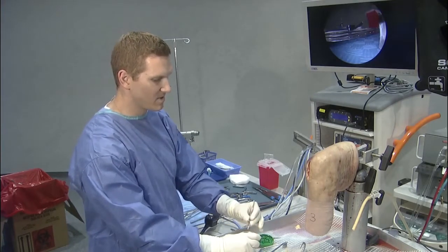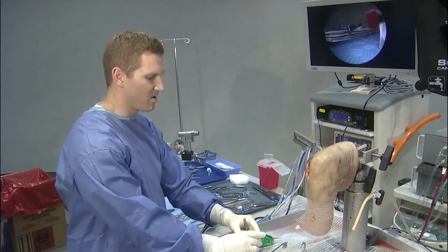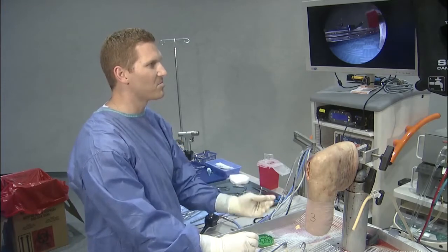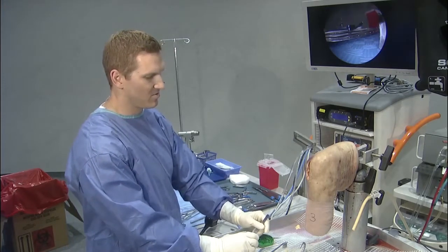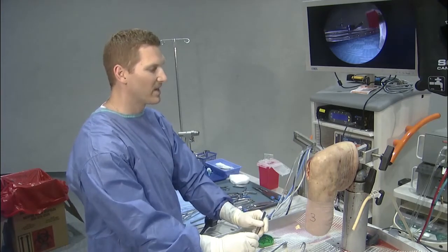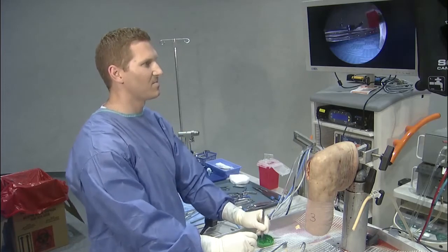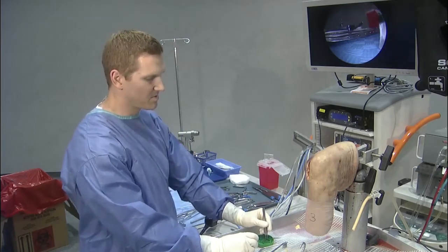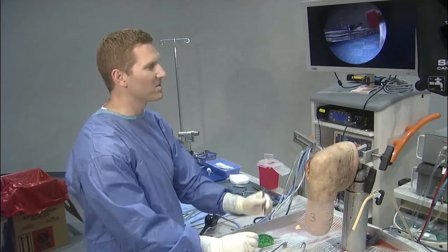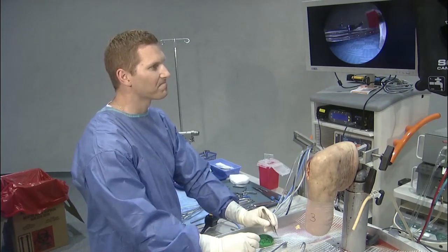I think one of the great things about this type of cartilage repair technique is if you have a very complex case, with a meniscus transplant, an osteotomy, sometimes a revision ACL, this is nice because you can plan that date for surgery and take the time that you need on your schedule. Sometimes with waiting for a graft, the timing can be a little bit tricky, the more complex the surgeries are.